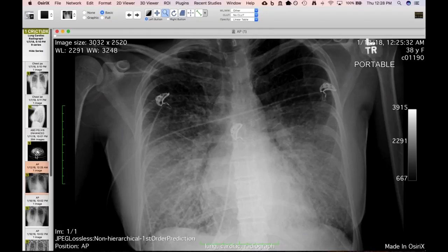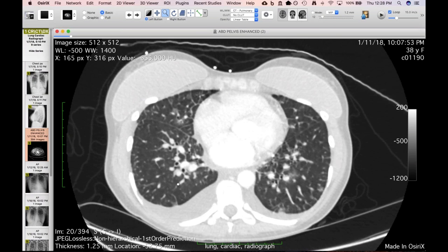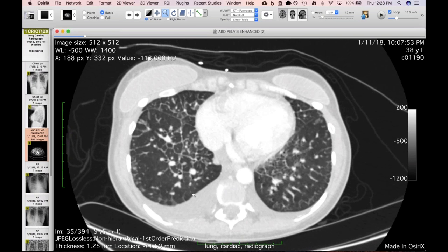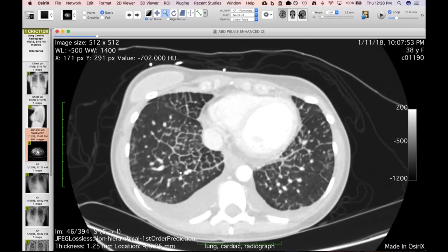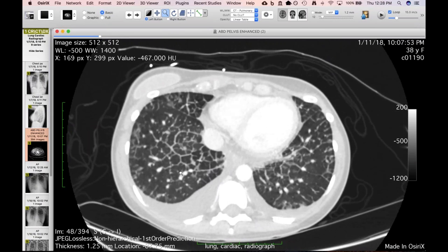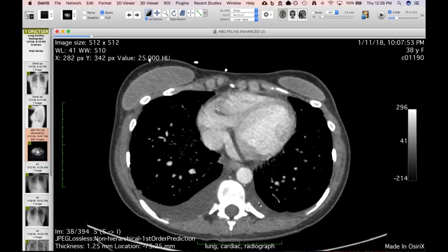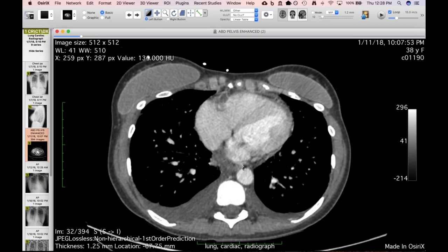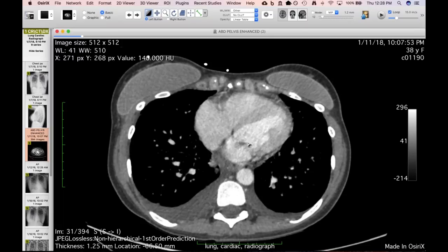I saw a follow-up radiograph, went back and looked at the abdomen and pelvis CT, and found a striking degree of septal lines at the bases — one of the prettiest examples I've seen, looking like sausage legs. We know it's edema because it was acute — not there five days ago. Knowing she had bacteremia, there appeared to be motion artifact suggesting a vegetation on the valve. She did have enterococcal endocarditis, which totally destroyed her anterior mitral leaflet.